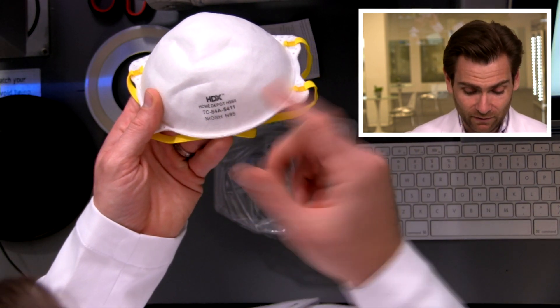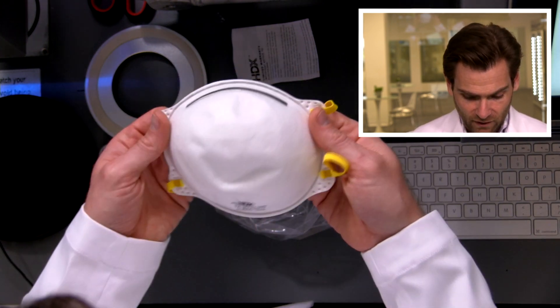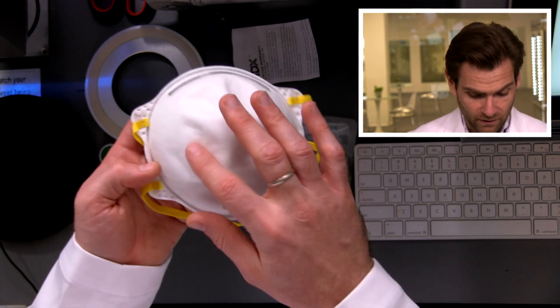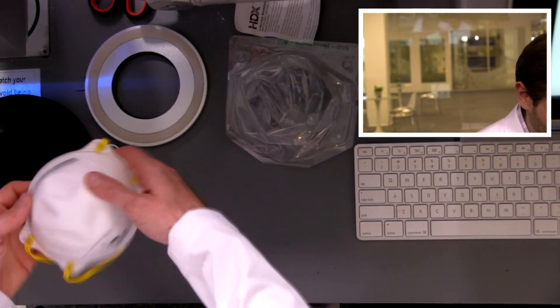This is the H950. I don't think they're making this anymore. It's got the nose foam on the top, it's just a simple cup shape, and it actually has — funny enough — a surgical covering on it to protect you from splashes, et cetera.